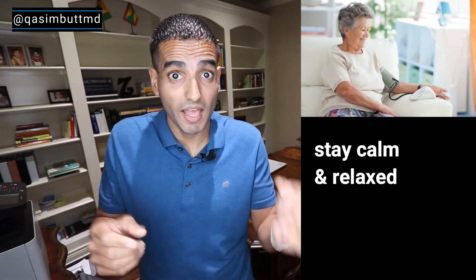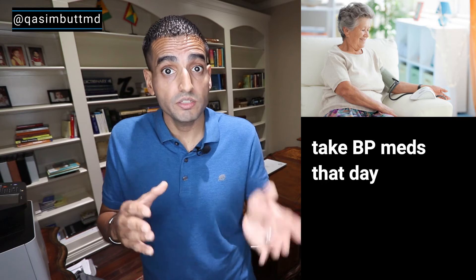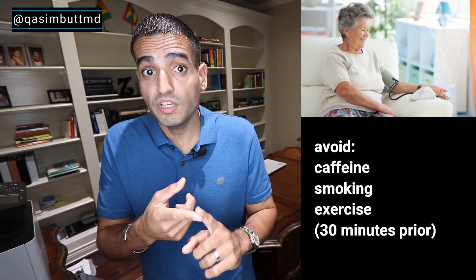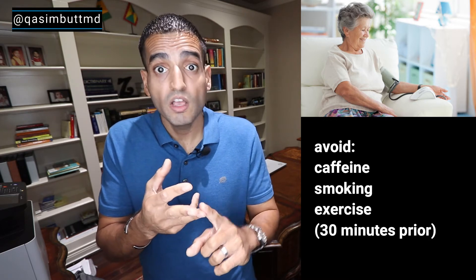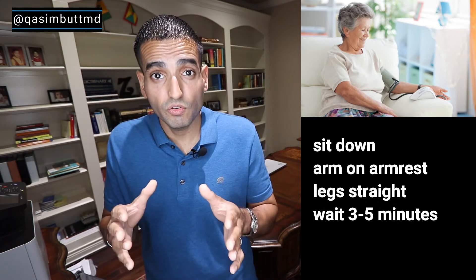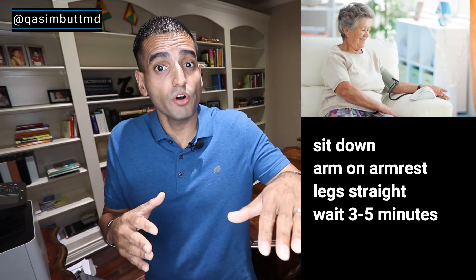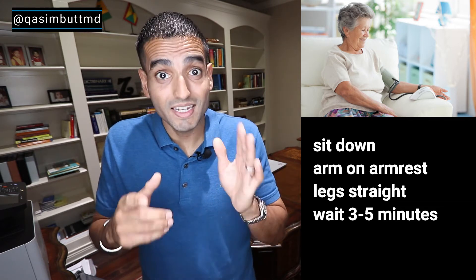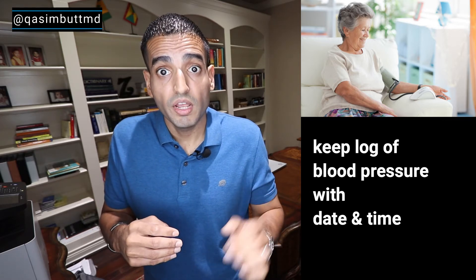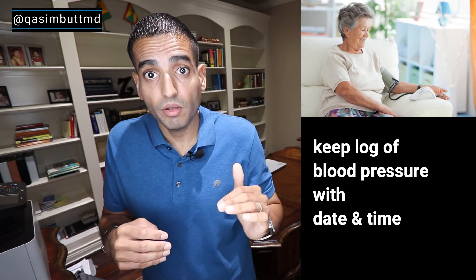How to check your blood pressure. Make sure you are calm and relaxed. If you are taking blood pressure medications, make sure you've taken them on that day. Make sure to avoid caffeine, smoking, or exercise for at least 30 minutes before you check. Sit down on a comfortable chair or sofa with your arm raised level to your heart. Make sure your legs are straight and not crossed. Wait about three to five minutes, then take your blood pressure. Make sure to write it down — the top number, the bottom number, and the pulse.